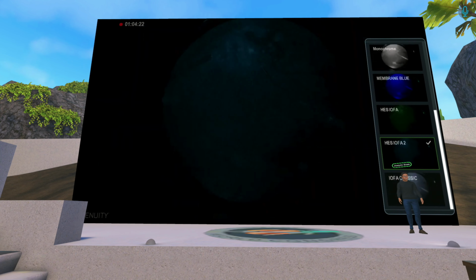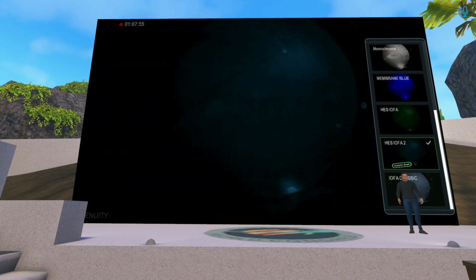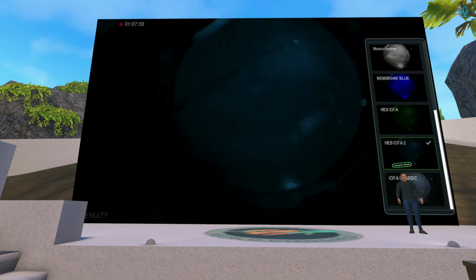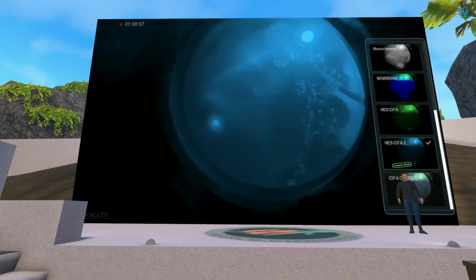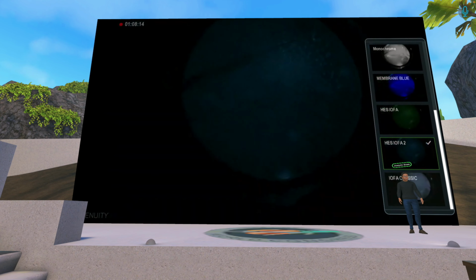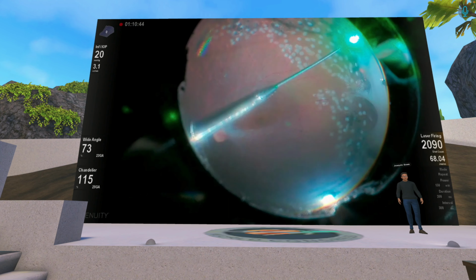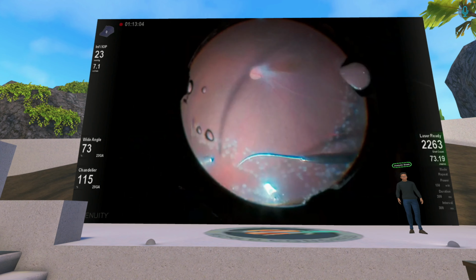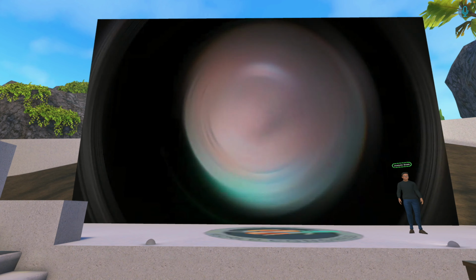So you only treat the areas you need to treat, preserving more visual field to the patient. As in the first case, we first delineate and then we complete the laser with the conventional illumination. We have three different filters, one green, one blue, and one grayish. That is my favorite, so we change into the filters in the case.